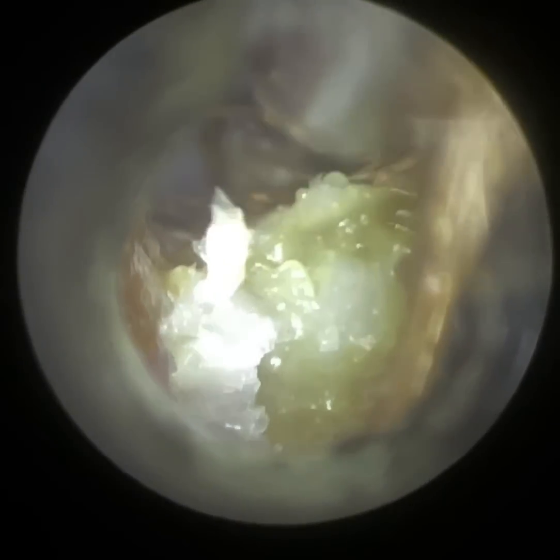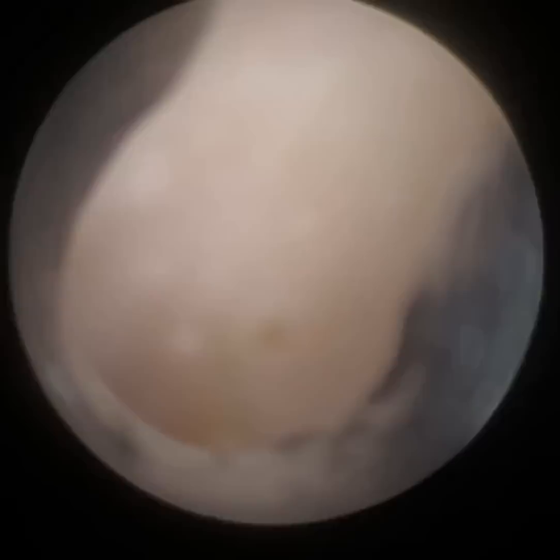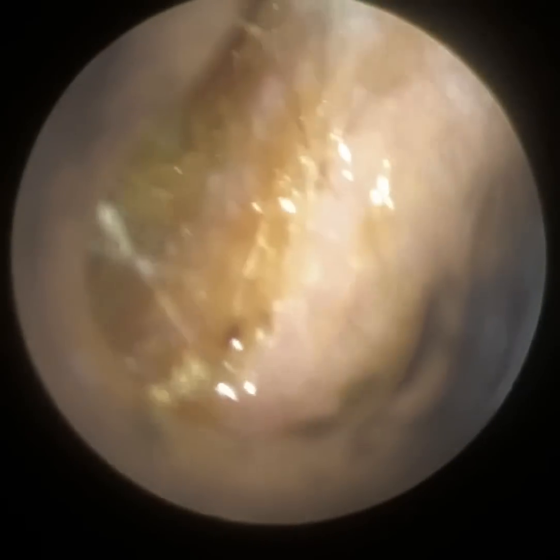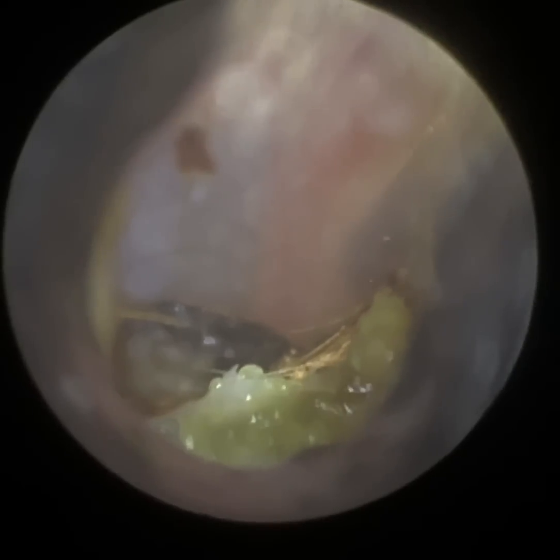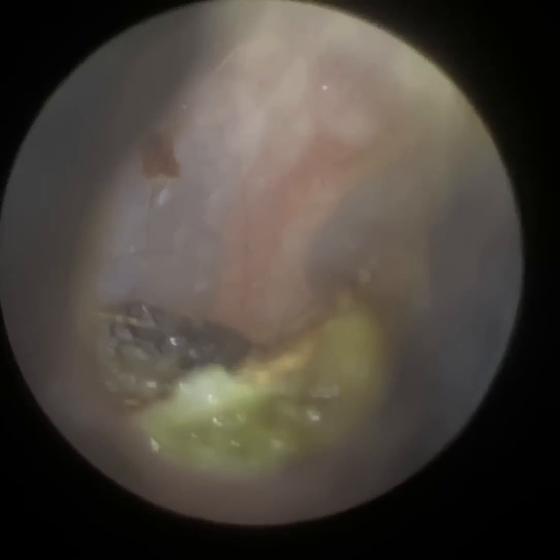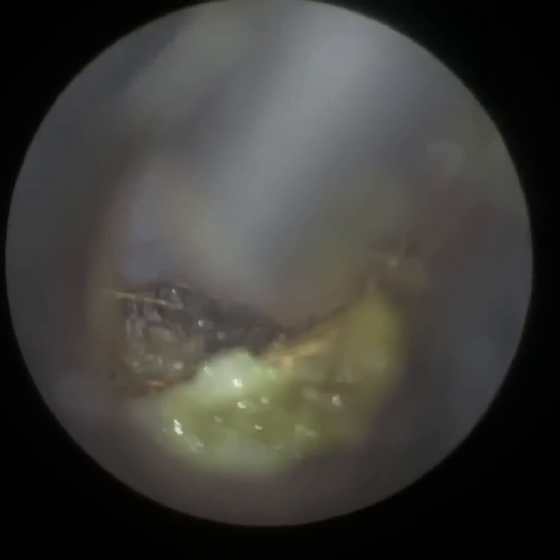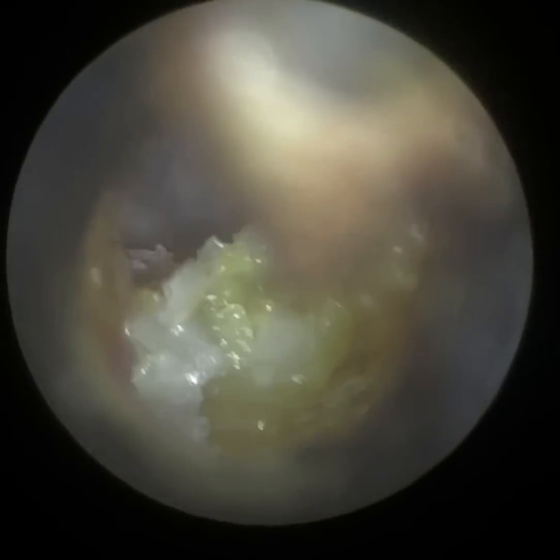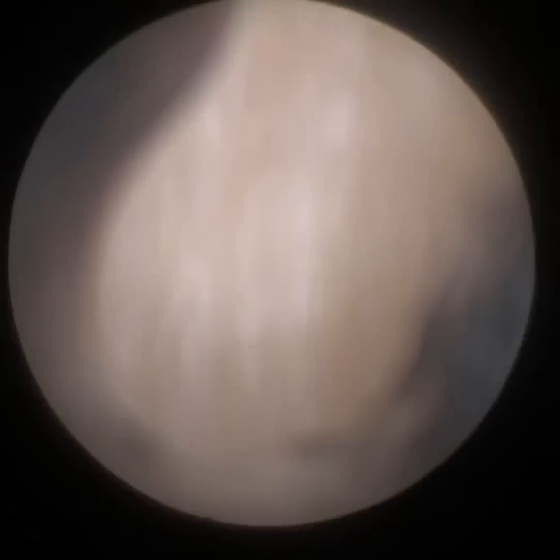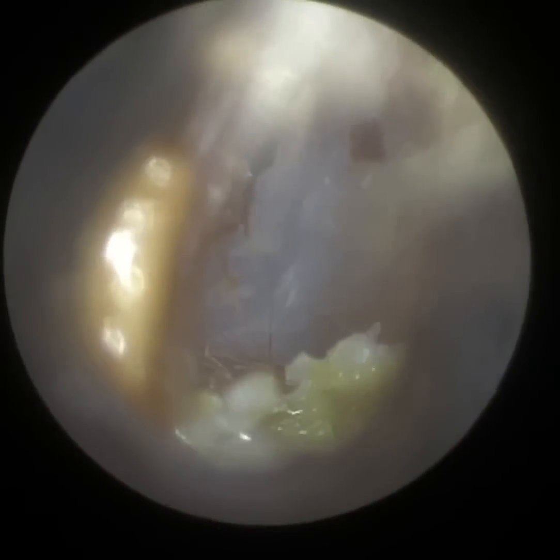Beneath this, we've got a very large ulceration — it's very medial. And essentially they've got a large widened area of exposed and eroded bone. To me, this needs to be diagnosed by an ENT specialist and it's probably going to go under a CT scan. But I do think it's very likely to be a canal cholesteatoma. I'm just getting this wax off the eardrum so I can refocus back onto this area. I'm going to start cleaning this out and you'll see the exposed bone.